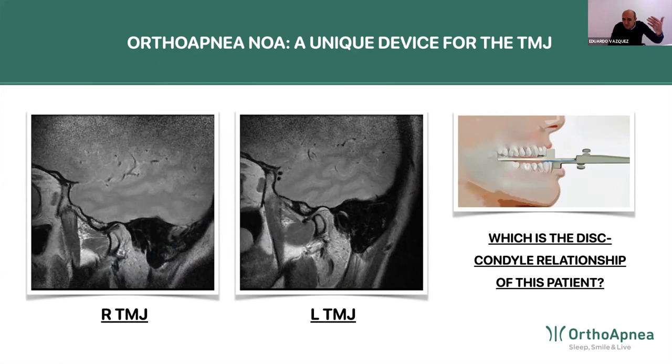The patient reported that in the past they had some temporomandibular disorder problems, but they were completely resolved, and at the moment the patient was asymptomatic. So we started the treatment of the sleep apnea problem with the MAD, and a few days later, the patient started developing pain in the left temporomandibular joint.